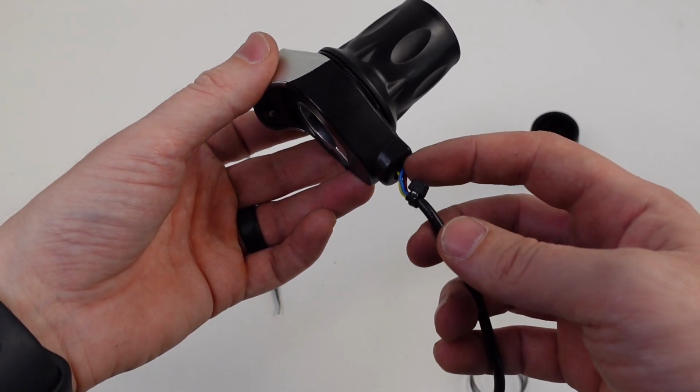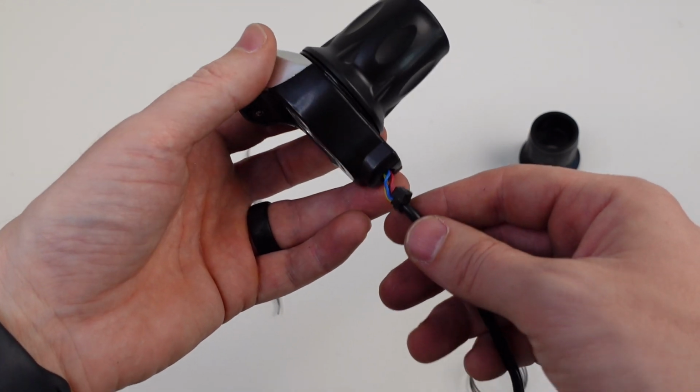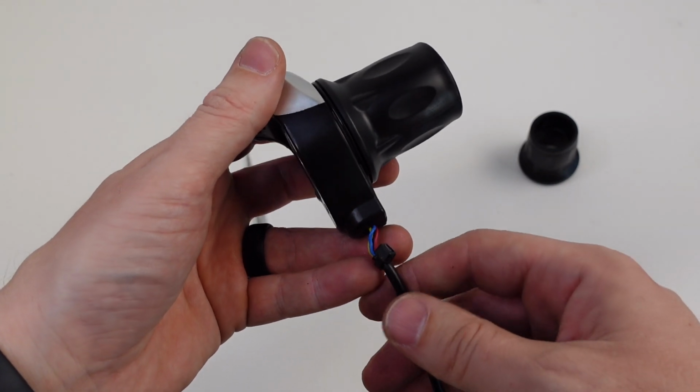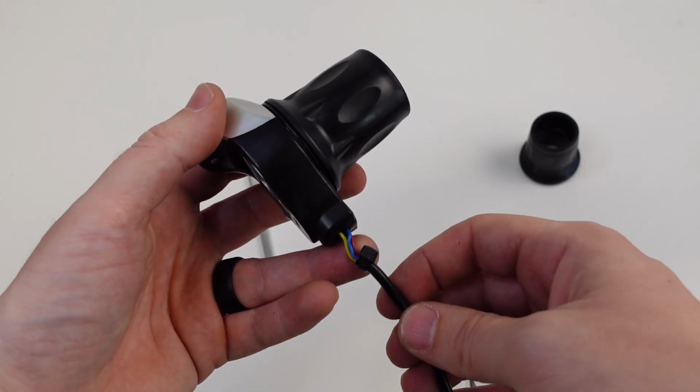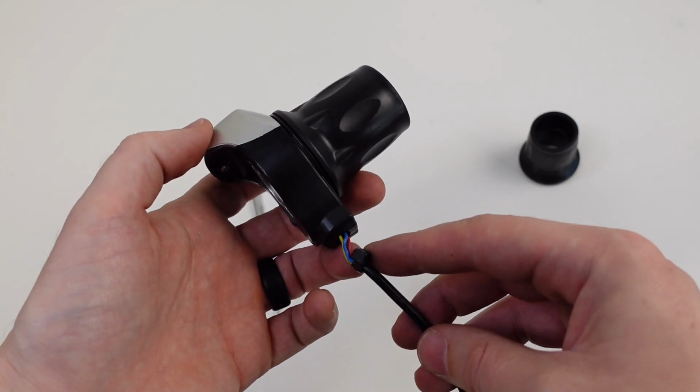As you can see, the wires were kind of torn out of the housing. Now this can happen if you're at an airport and someone's just really roughly managing your wires and they just pull down and it came out. It is very rare, you don't really see this too often, but it has come across my desk a couple times, so we'll go over it today.